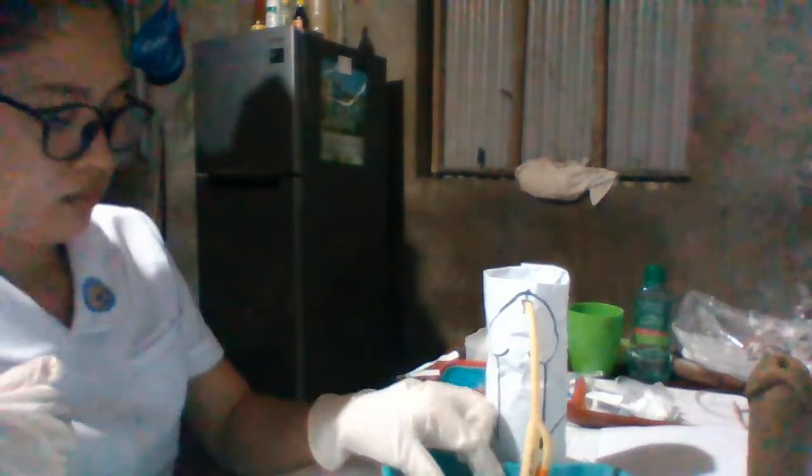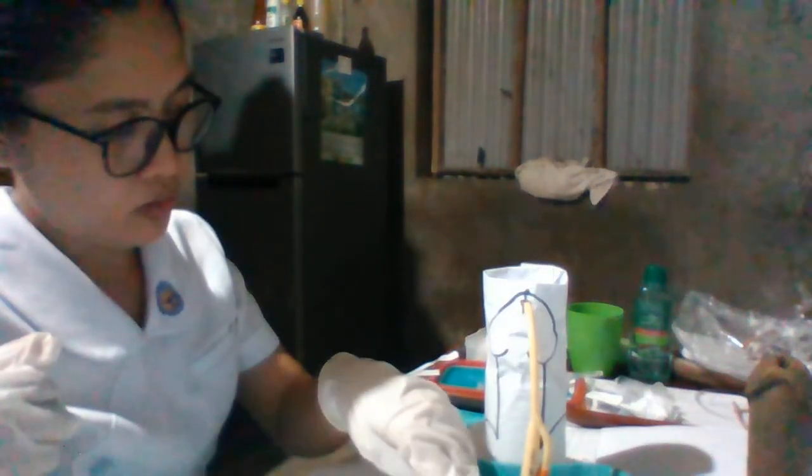Then collect the urine specimen as needed, at least 20 to 30 ml.